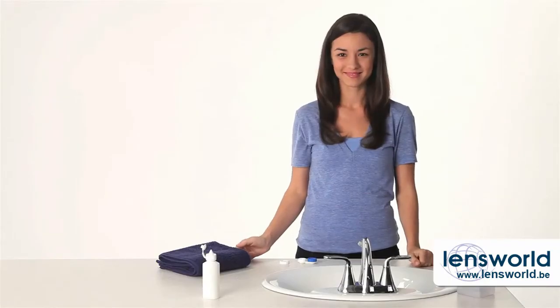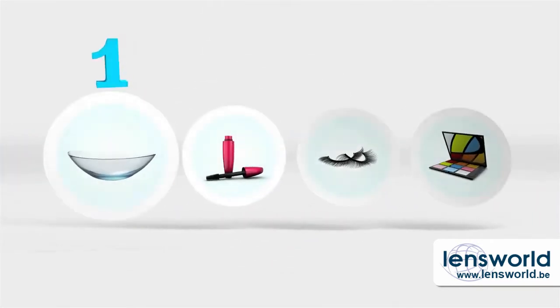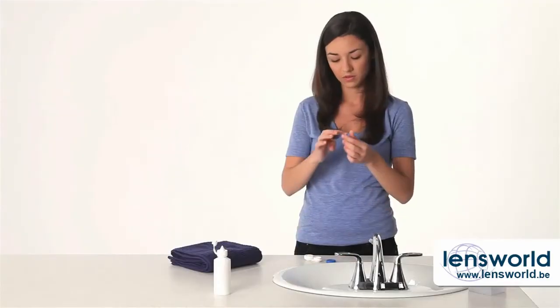When the lens is all the way on your eye, slowly release your upper eyelid and close your eye for a moment. Blink a few times and look around to center the lens. And that's it. One more tip: if you wear makeup, put your contacts on first so any makeup on your hands doesn't wind up on the lenses. Now do it again with your left eye.